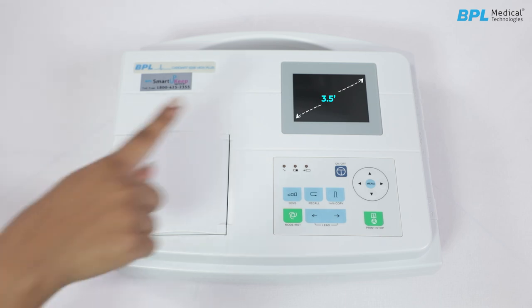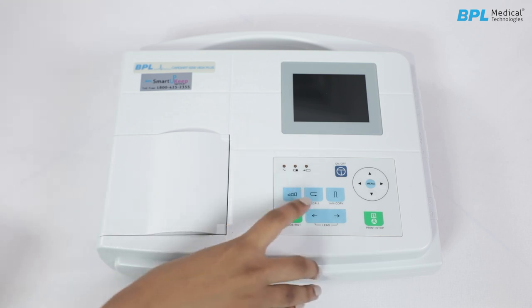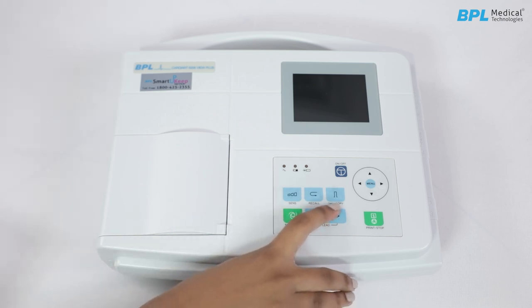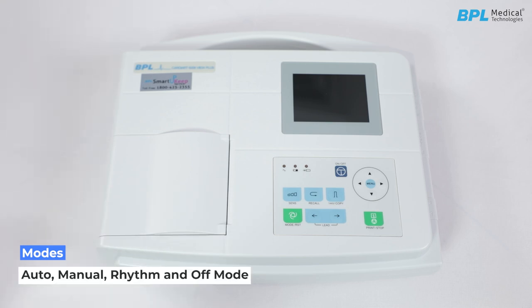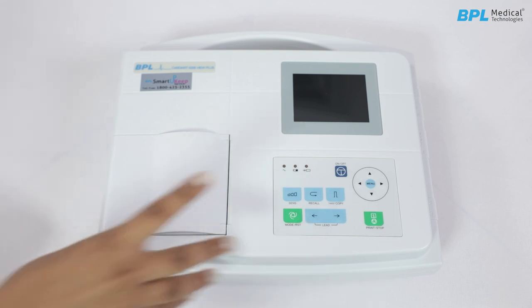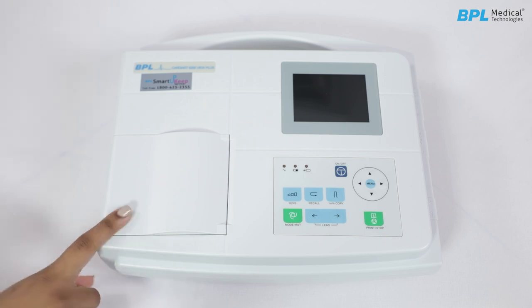At the top panel, there is a 3.5-inch LCD screen. Sensitivity key to adjust the gain. Recall key to review patient files saved in the recall window. 1 millivolt or copy key — under manual mode, records the 1 millivolt calibration pulse during recording; under auto mode when the LCD prompts copy, use this key to recall the previously recorded ECG. Mode or reset key to select recording mode: auto, manual, rhythm or off. Lead switch key to switch between leads during manual mode. Print or stop key, menu with the navigation key, and a paper compartment on the left.